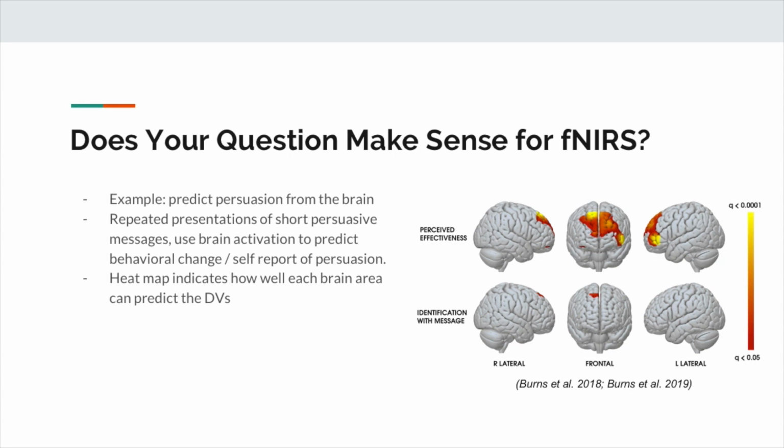That's because that's kind of as far as we think we were able to record activity from. In these papers, we're only doing prefrontal recording, and the farthest optodes out were right about here. So that cutoff is saying, I don't think I'm recording any activity past this. The reason the other lines look so smooth is because this is linearly interpolated. If we were just plotting it in a very basic way, you would see a more blocky grid over the front of the head, where you say this channel, which is a centimeter, has this value, this channel has this value. This is just smoothing the data between them to make it look nicer.